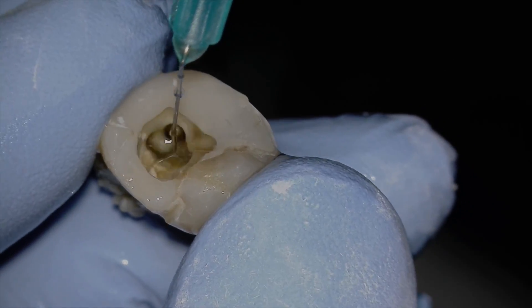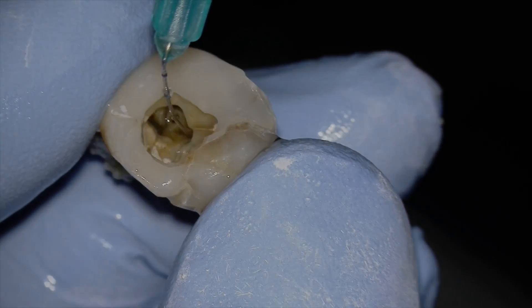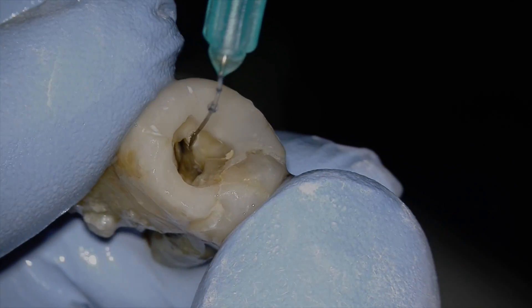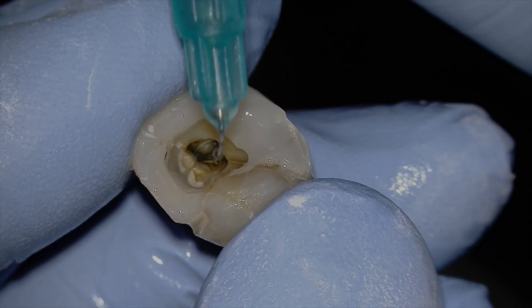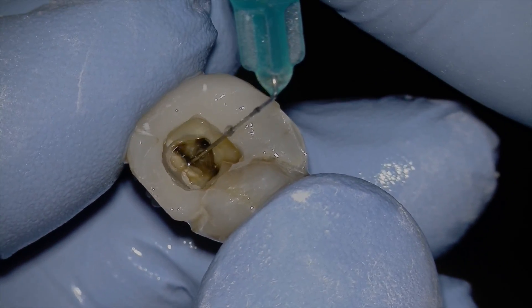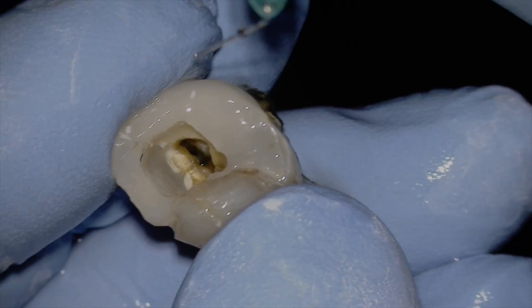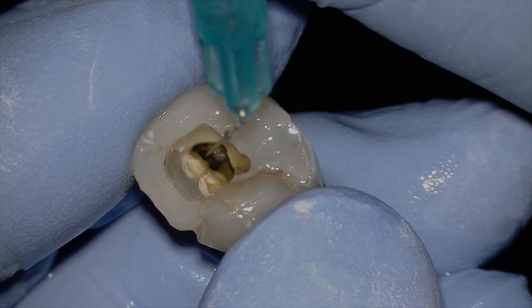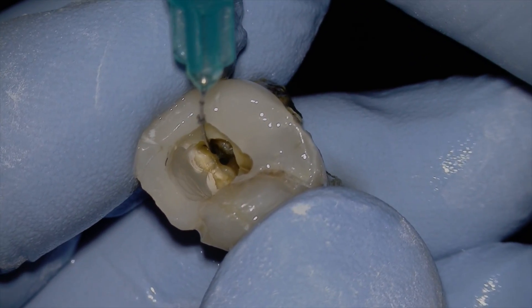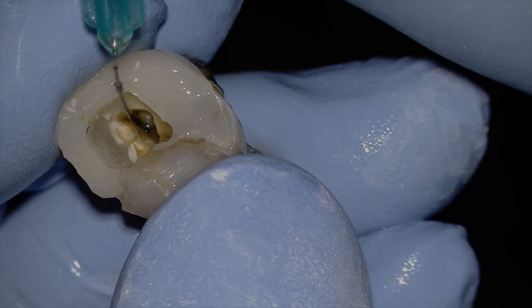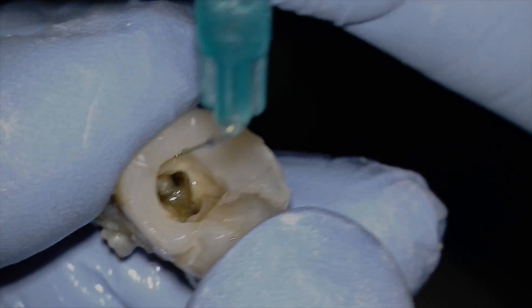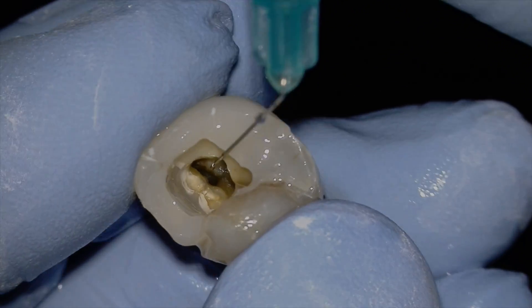So the key to great endo is irrigation. Like lots and lots of irrigation. And the key to reproducible working lengths is to not have a lot of irrigant in the pulp chamber. And even less in the canal. So one of the tips that I do before I go to get my apex locator reading is to use the syringe just to suction out. So I pull back on the plunger to suction out most of the irrigant out of the pulp chamber, but also the orifices in the canals.